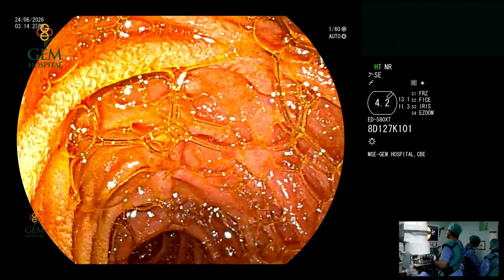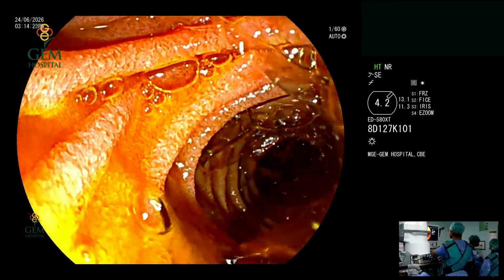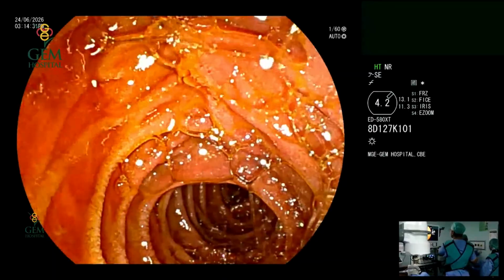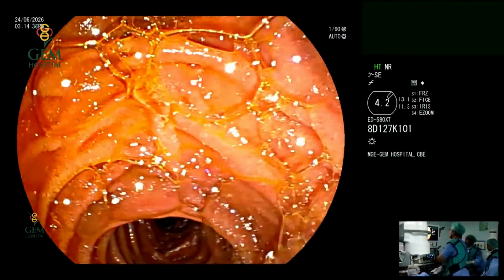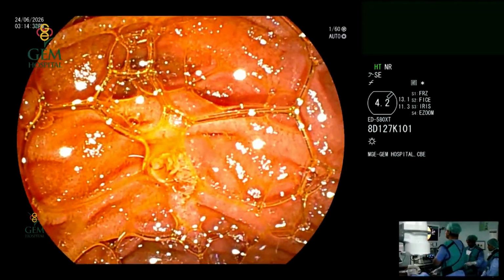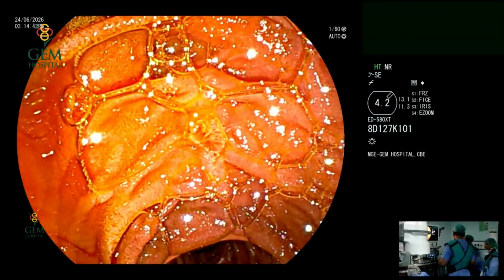What you see here, don't be premature and fooled into thinking it's the major papilla. Make sure you shorten the scope and just try to look for the frenulum. The papilla always has a frenulum beneath, and as you trace the frenulum, you can see the papilla here.